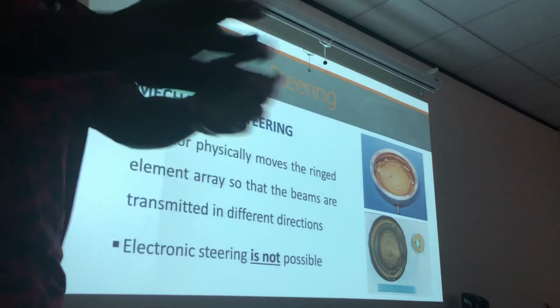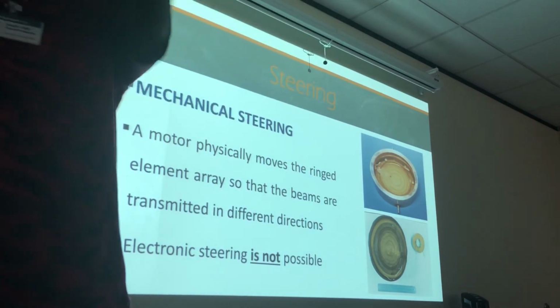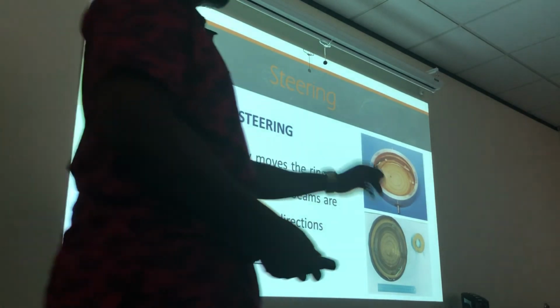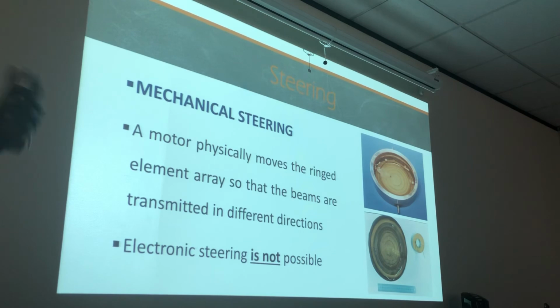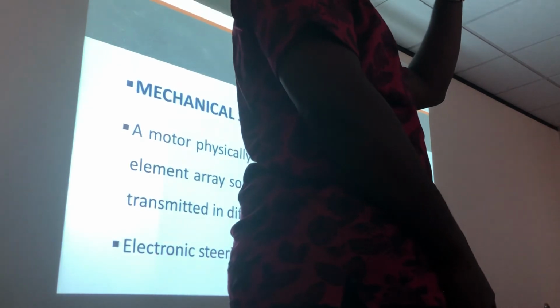Remember, we're talking about steering. This is steering, right? Creating that sector-shaped beam. This is steering right here. Okay? So that's what's happening. So this actual transducer is being steered mechanically by a motor. What else is steered mechanically, Miss Cecile? The mechanical. There we go. That mechanical transducer is also steered mechanically. Those are the only two transducers, guys, that have anything mechanical.